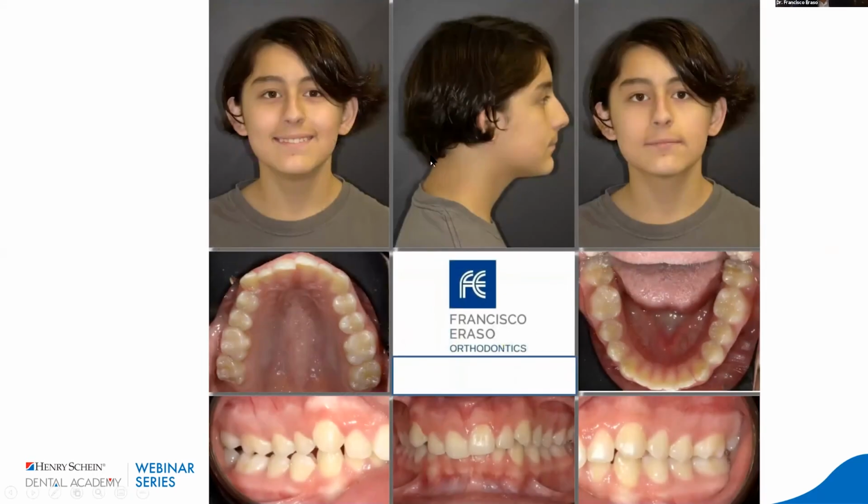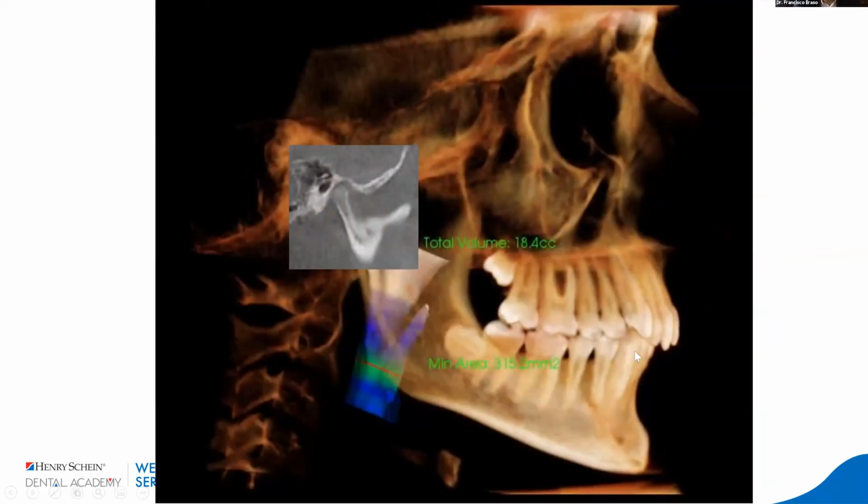So this is Alejandro. Alejandro is a 12-year-old patient, deep bite, bilateral molar and canine class 2. Very difficult case to correct with different modalities. I try to be as simplistic as I can. I'm going to use a short motion appliance on the right side, conventional length on the left side. This is the picture of Alejandro before the treatment, before I decide to do motion.